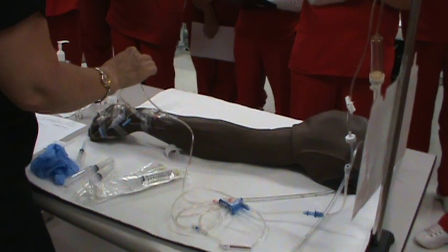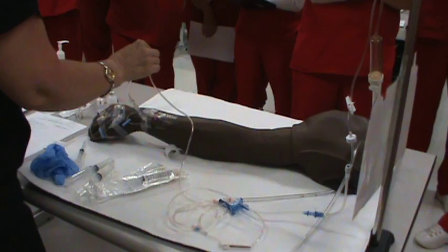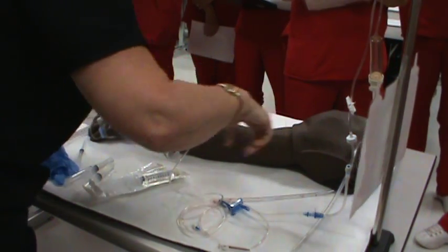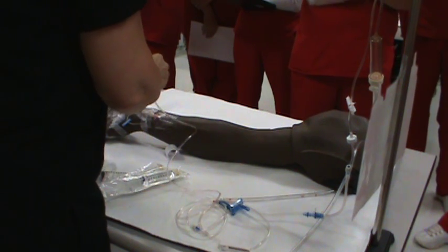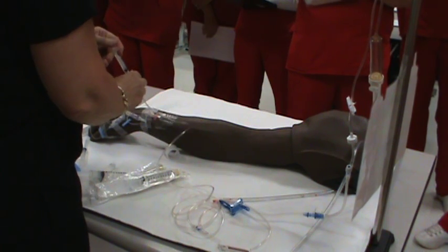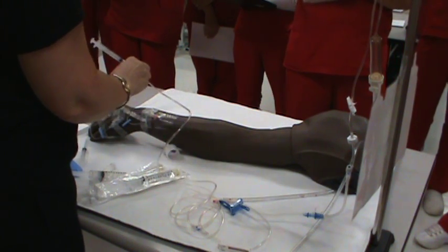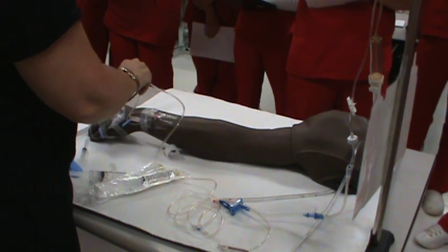Clean injection port, occlude infusion tubing just above the injection port, slowly inject the medication. If it's compatible, then you just hit pause. There's pause. And then get your medication. Slowly inject it, verbalize the appropriate time. So if it's over 3 minutes, push 1 ml, wait a minute. Push another ml, wait a minute. Push the third ml, wait a minute.